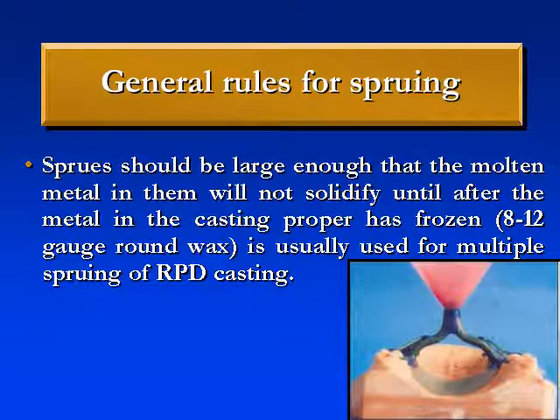So the sprue means a piece or channel made from wax that allows the pathway for entrance, connecting the crucible former, which is the triangular pink piece in this picture, to the metal framework wax-up, which is made on the refractory cast.